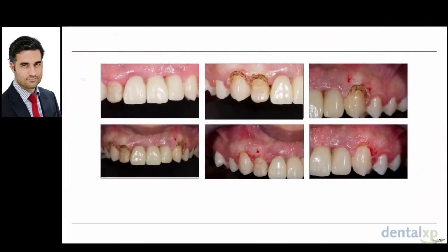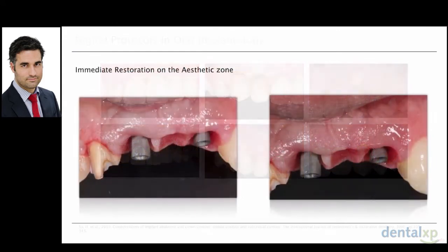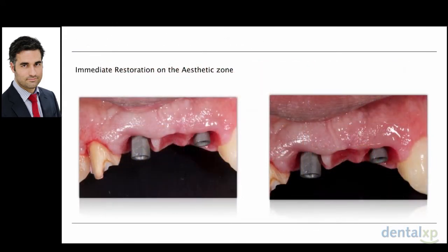After getting our definitive emergence profiles, and feeling happy with them and with the study results, we decided to prepare a veneer on number 12, and to do a gingivectomy with an electric scalpel. So we prepared for the definitive impressions.